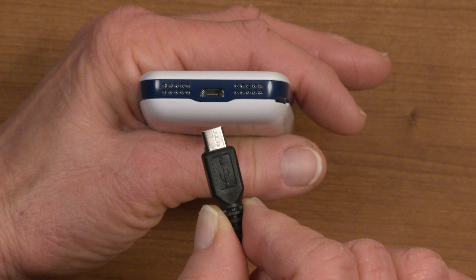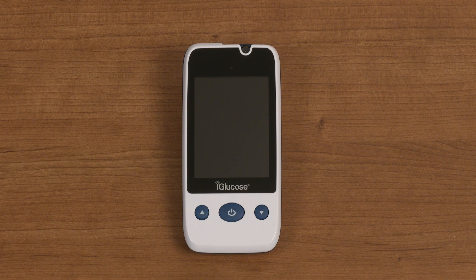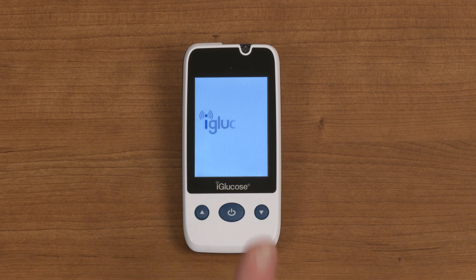At the bottom of the device is the charging port. It is important to fully charge the battery before your first reading. To turn on your iGlucose Meter, press and hold the home button until the meter turns on. You will see the display light up and may hear the meter chime three times.